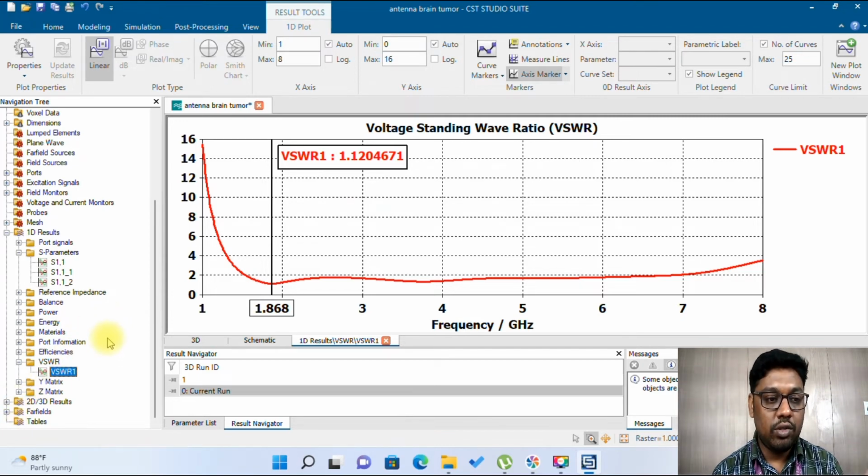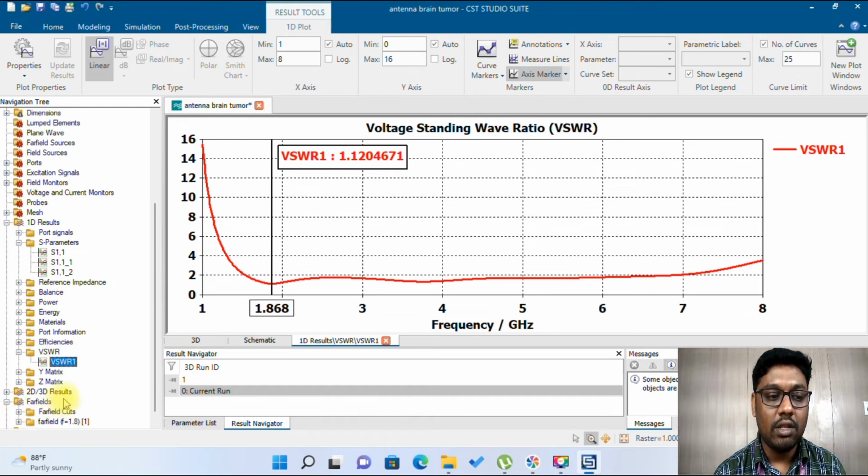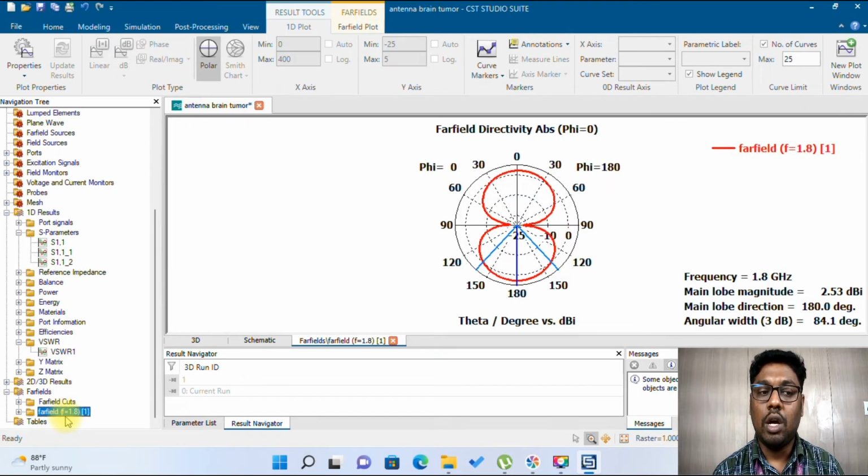And after that, once you complete the simulation, you can see that the far field result is there. So in the far field, you need to simulate once again for the corresponding resonant frequency, because once you see the S11, that is your reflection coefficient graph, you can identify at what frequency your antenna has resonated. Okay, so choose that antenna resonance frequency, and for that particular frequency you need to calculate your far field, so that you can detect your E field radiation pattern, your H field radiation pattern, your directivity, your gain. All these parameters you can calculate for your resonant frequency.